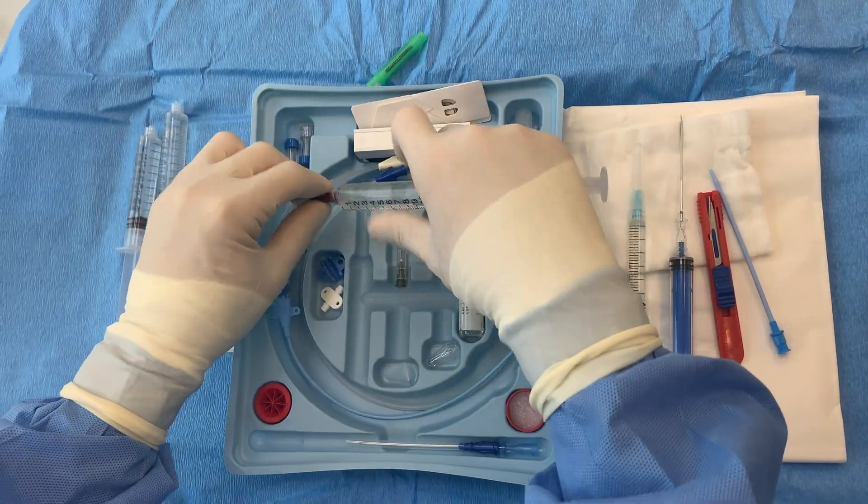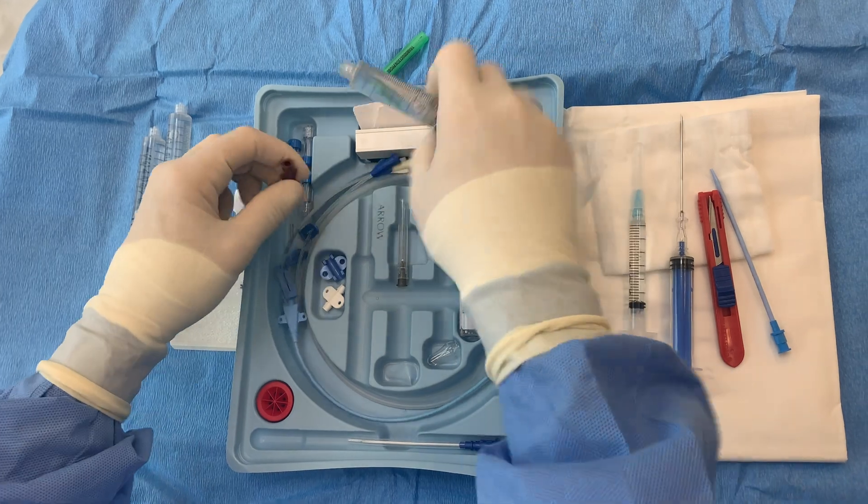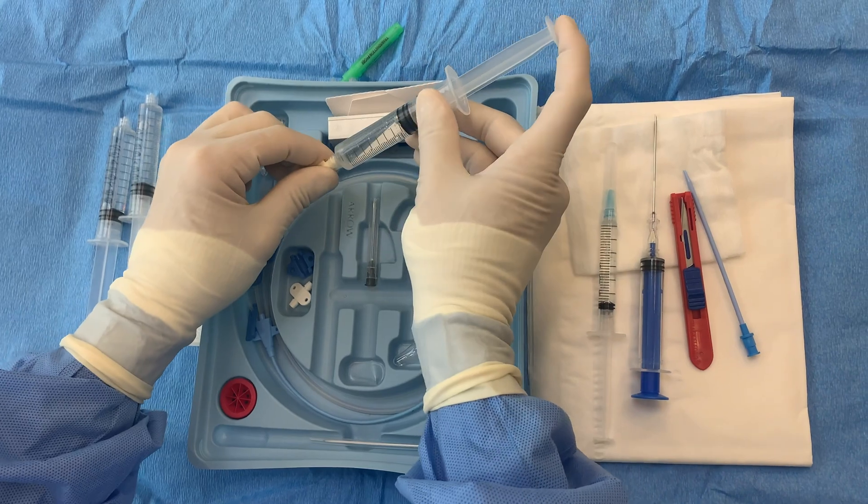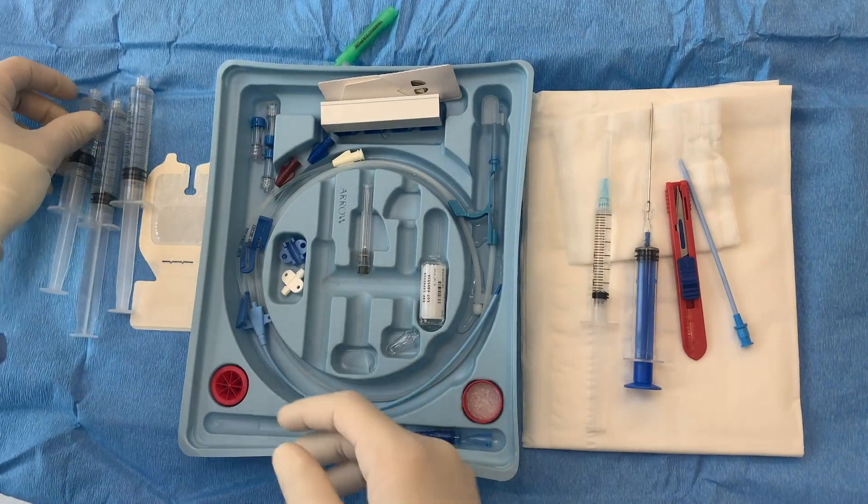Finally, prepare the catheter by removing and connecting the appropriate caps and flushing each port so that the line is ready for insertion.